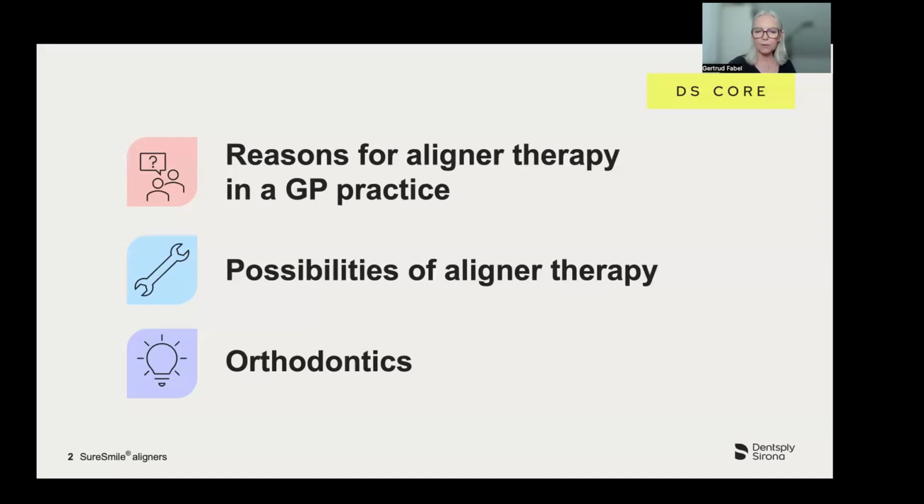Once the aligner is ordered, it takes about 2 weeks for delivery to the patient. The first appointment involves adjusting IPR and fixing the attachment using the attachment template. Patients should receive advice on the timing, use, and changing interval of the devices. Hygienist cleaning appointments are usually recommended every 8 aligners.